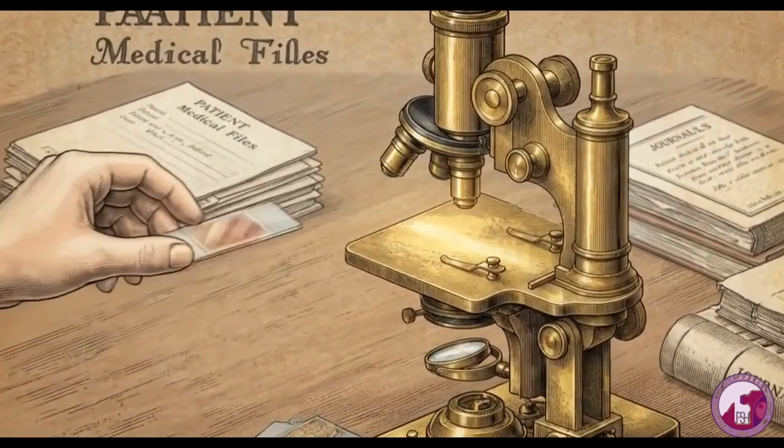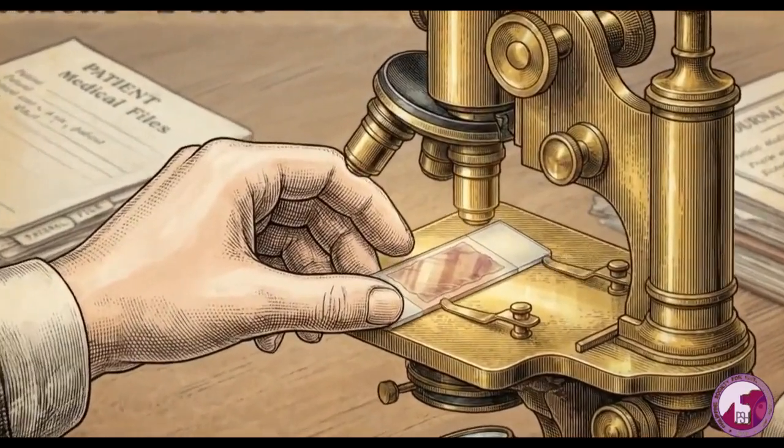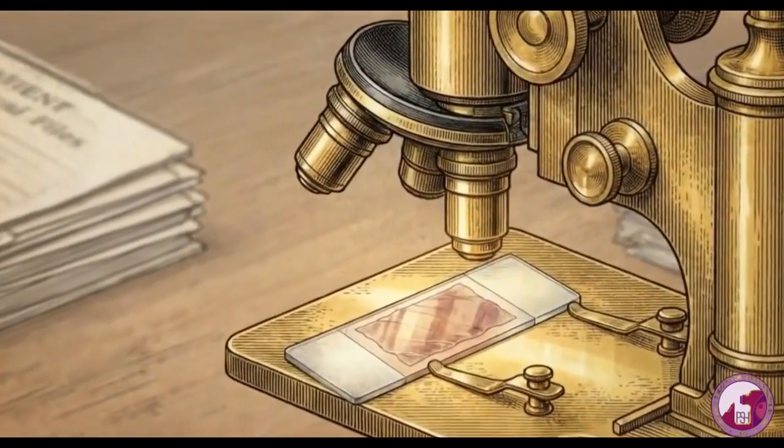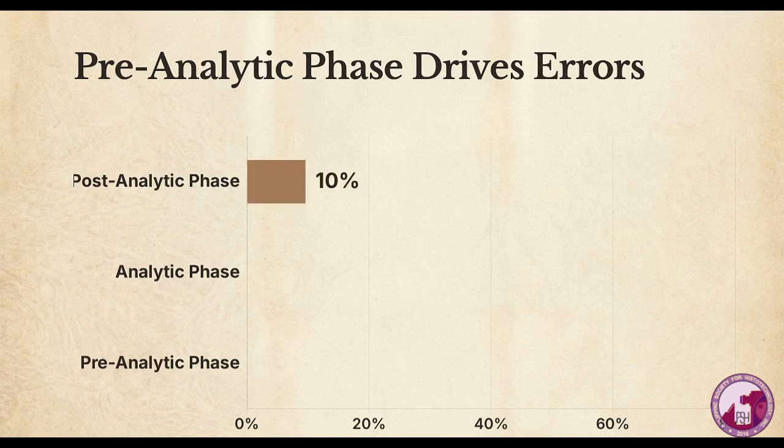Staggeringly, between 10 and 20% of all cancer patients are misdiagnosed every year due to improper immunohistochemistry staining. When a slide fails, the instinctual reaction in the lab is almost always to blame the chemistry. We assume the reagents are bad. This chart shows the actual origins of IHC errors, and the chemistry is rarely the culprit.